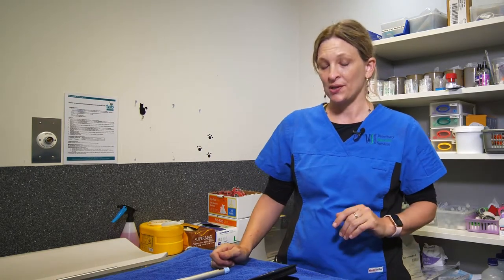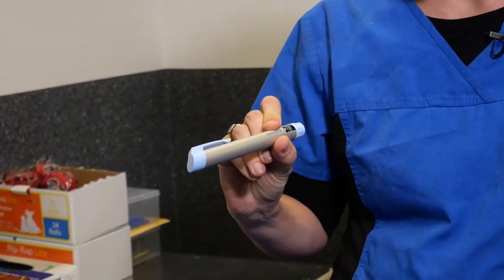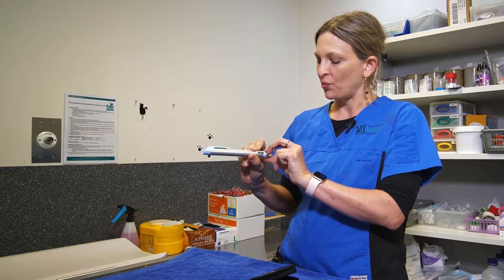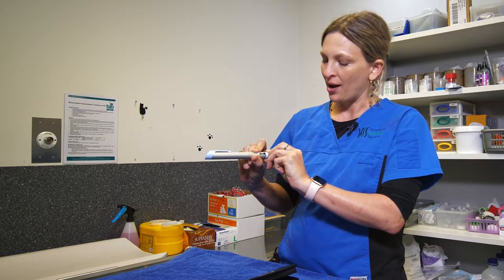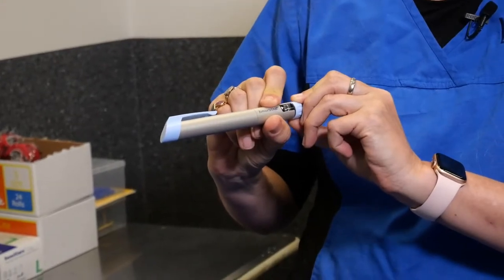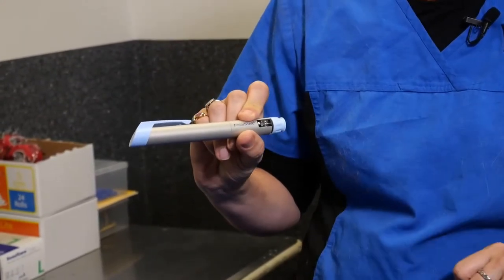The one that we'll focus on primarily is the Junior Star pen, and this is a really great pen because it's one of the few pens that allows you to do half doses of insulin, which sometimes we might need to use in our cats.